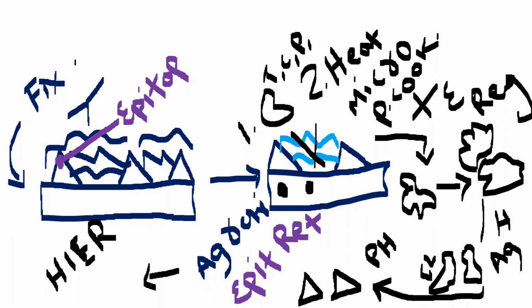So far we discussed fixation last week, the importance of fixation of tissue. And in today's lecture we are discussing how to retrieve our antigens from the tissue. This antigen retrieval can be done either by using specialized enzymes or with the help of some heating techniques. Enzymes such as chymotrypsin, trypsin, and proteinases can be used, whereas for heating techniques we can use microwaving, pressure cookers, autoclaves, pressure cooker with enzymes, or even specialized solutions that can remove these crosslinks among the antigens. Okay, so let us see the notes on this antigen retrieval.